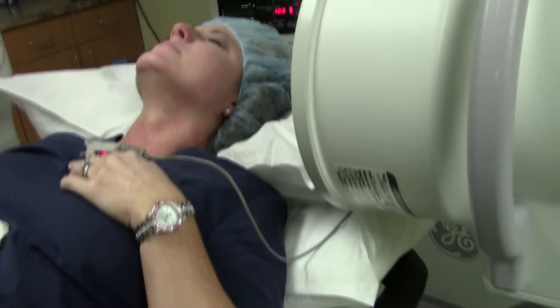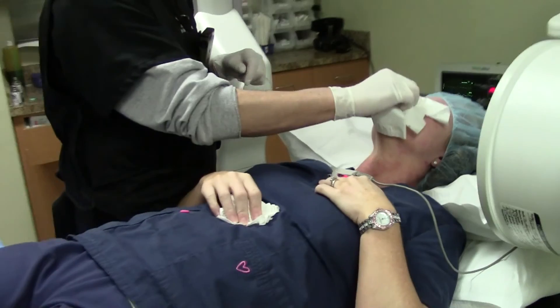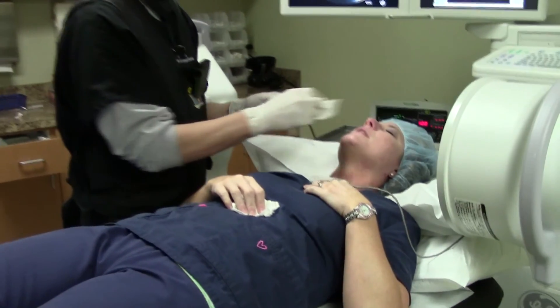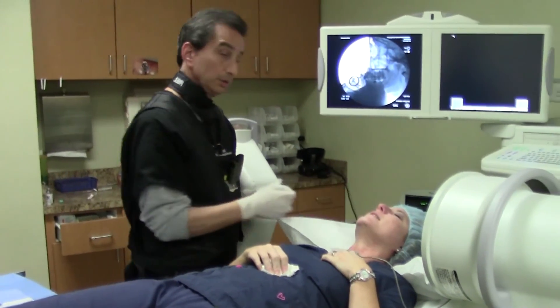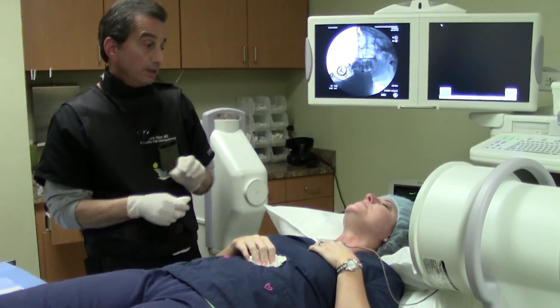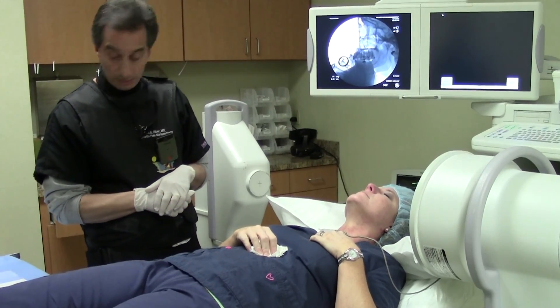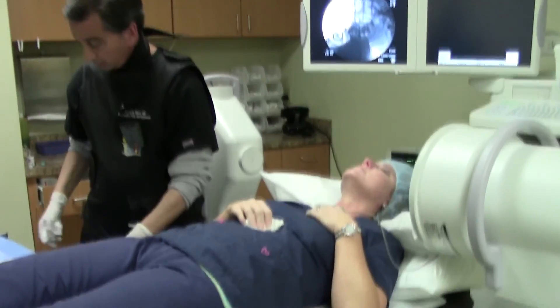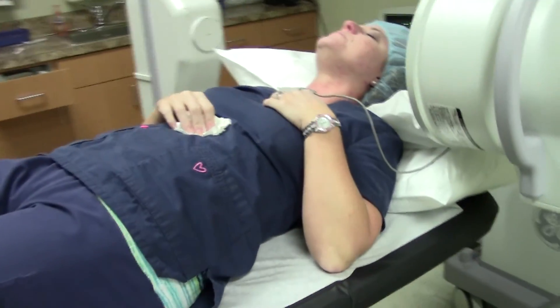Once the treatment is completed, we keep the patient supine with the neck slightly extended for approximately 10 minutes and discharge them once they are feeling fine, as long as they don't have any residual numbness in the throat.